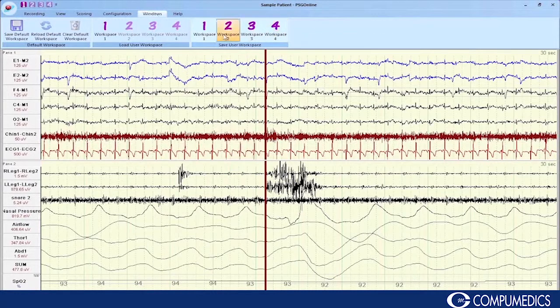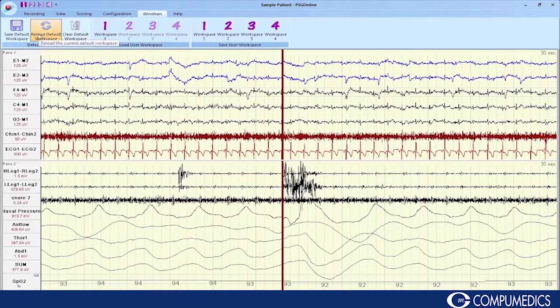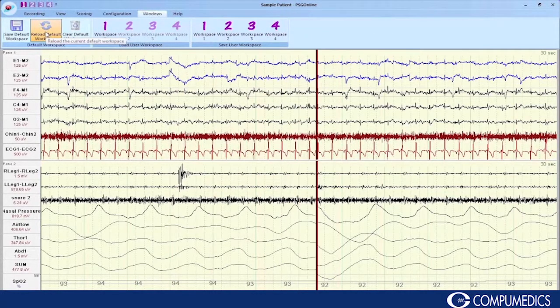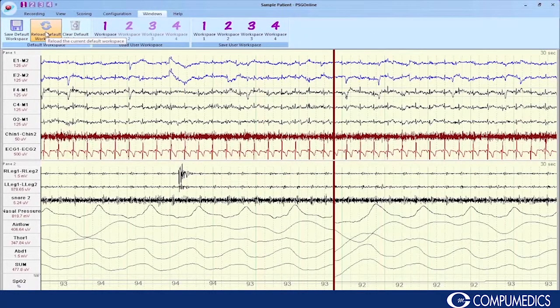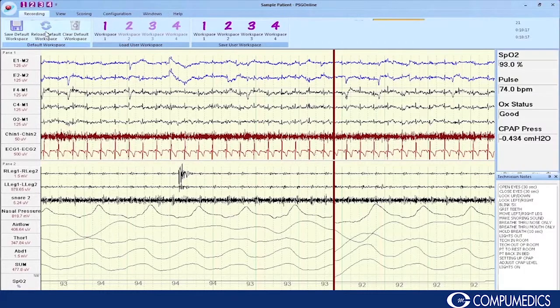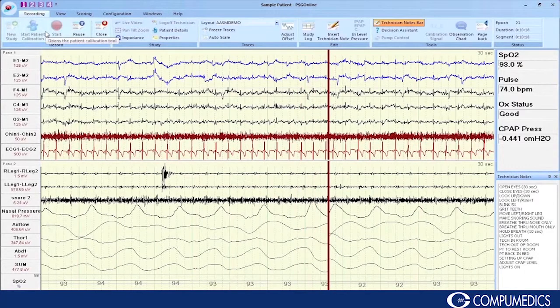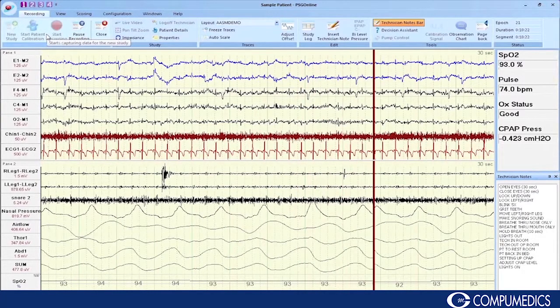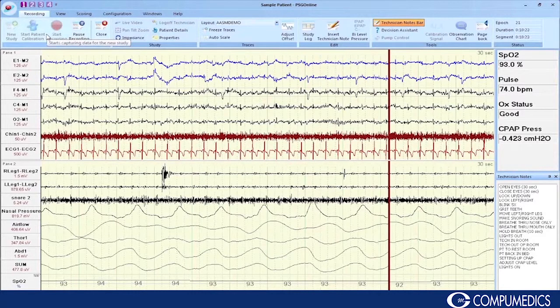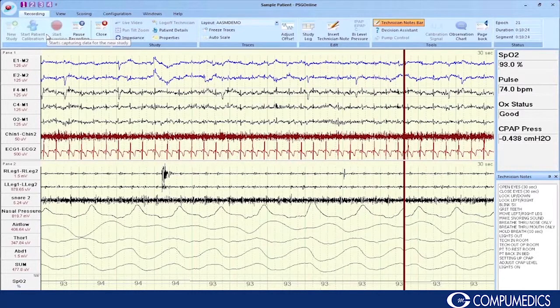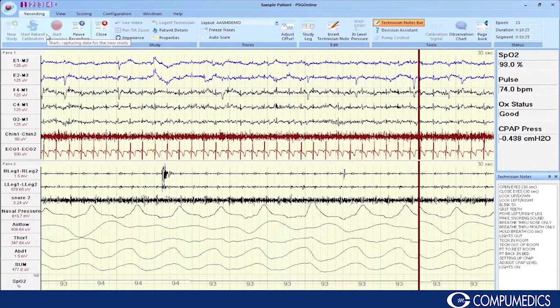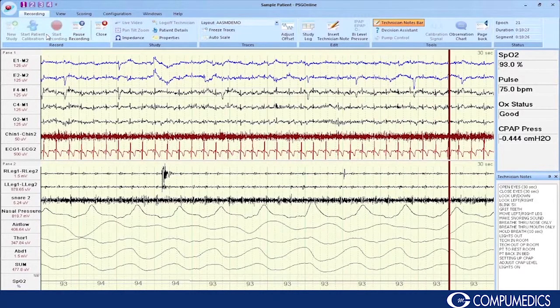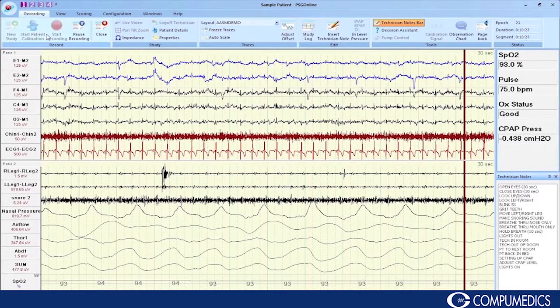Another feature is auto recovery of a default workspace. The ribbon bar interface, additional customised workspaces, and auto workspace recovery make the software easy to use for both veteran recording technologists and new trainees.